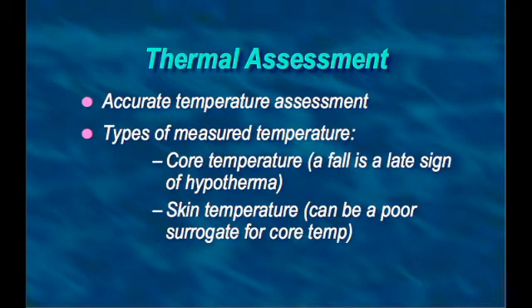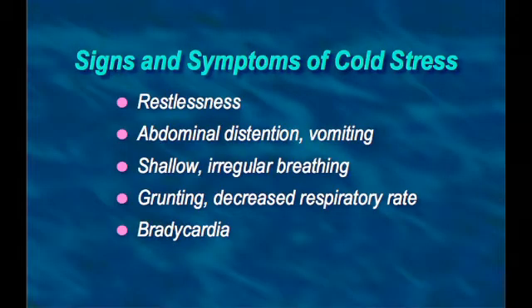So you have to look at how you're measuring the baby. Obviously, issues of probes falling off and not being accurate are important to assess and to help manage. So thermal assessment is something that has to go on regularly, continuously, and be part of all protocols, particularly as the babies are preterm. Now, what if the baby is getting cold? How do you know the baby is getting cold?